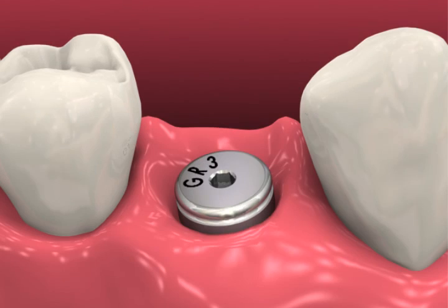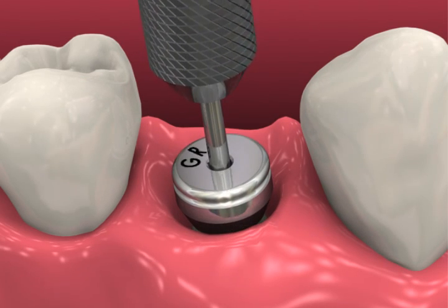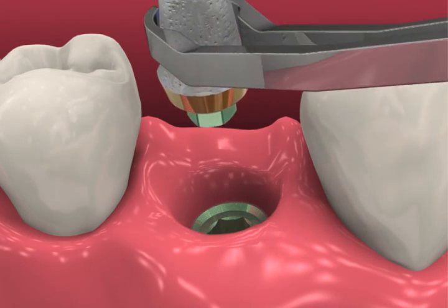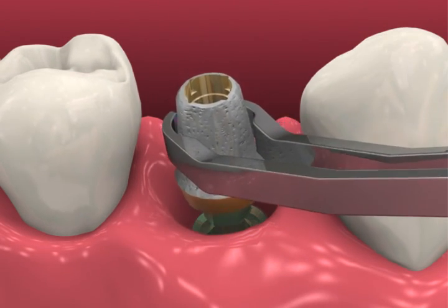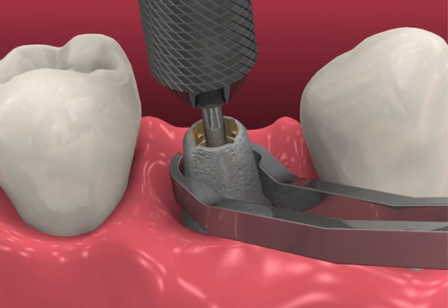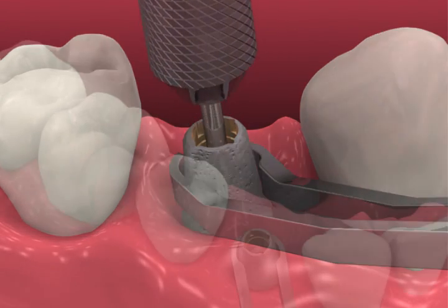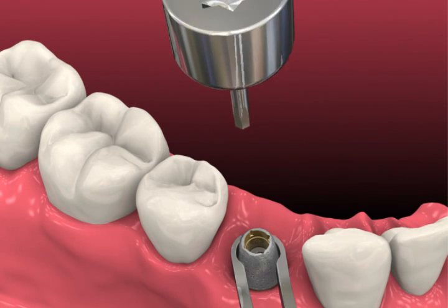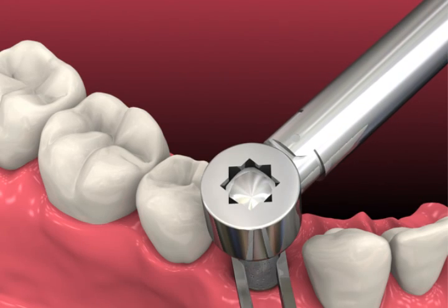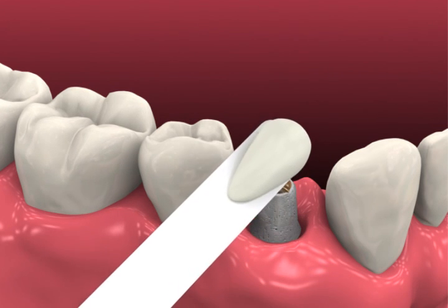At the second restorative visit, remove the healing abutment or provisional prosthesis and irrigate the prosthetic platform to remove any debris and dry thoroughly. Seat the prepared abutment in the patient, being certain to maintain the same orientation as was found on the model. Hand tighten the abutment screw with the 050 hex driver and radiographically verify complete abutment seating. Apply 30 newton centimeters of torque to the abutment screw with a calibrated torque wrench. An abutment clamp may be used to help shield the bone implant interface from excessive stress.